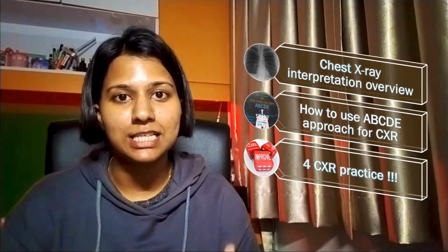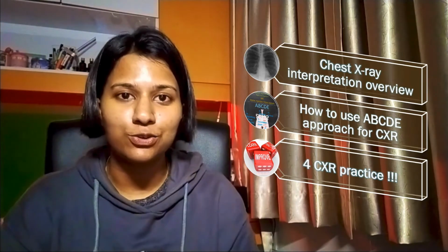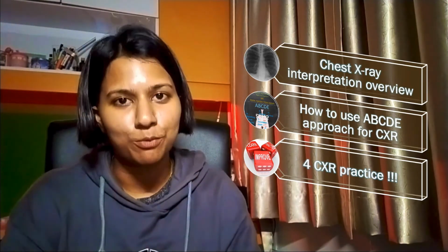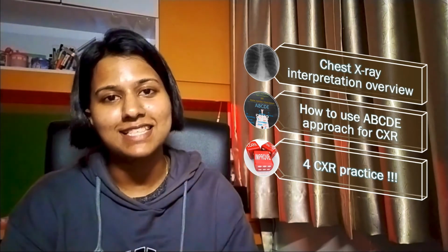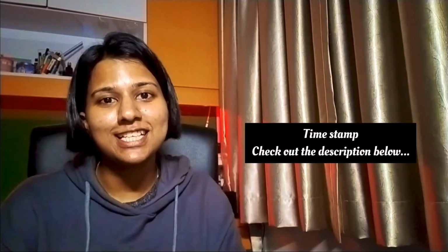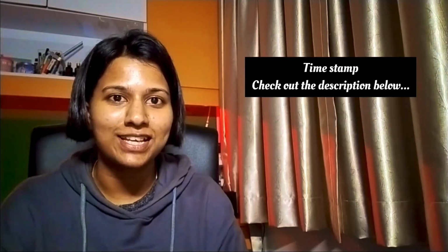So in this video, first I'm going to cover what are the things you need to be writing down in your chest X-ray notes, and then I will guide you on how to use the ABCDE approach, and finally I will take you through 4 sample cases using the ABCDE approach. I hope by the end of this video you will be confident enough to comment on a chest X-ray on your own. Check the description below for the timestamps if you want to focus on a particular chest X-ray to save your time. Enjoy!